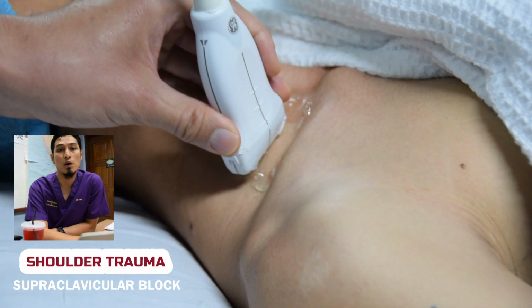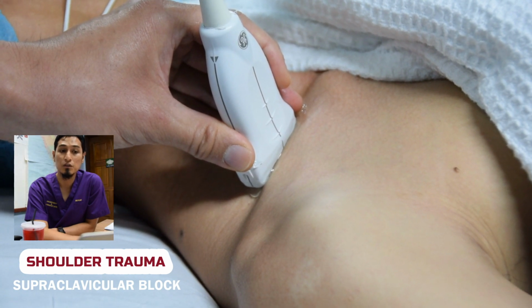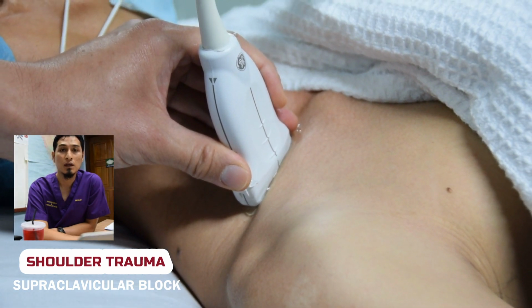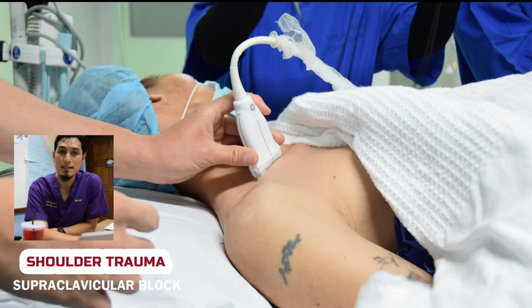In this video, we will show you how to perform supraclavicular block for shoulder trauma. This block can be performed with the patient in supine, semi-sitting or slight lateral position with the patient's head turned away from the side to be blocked.